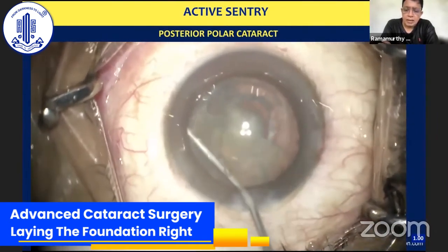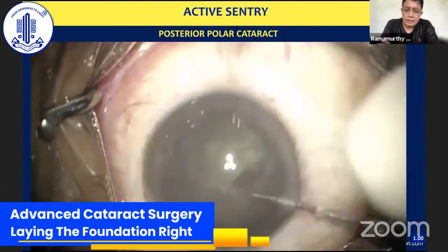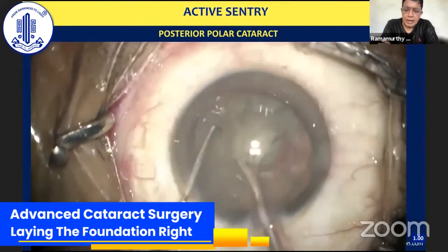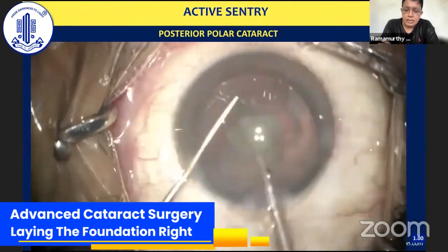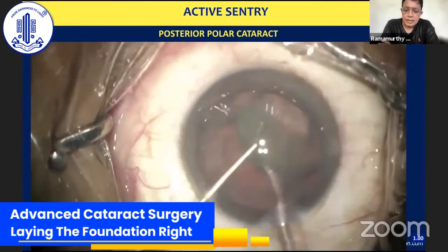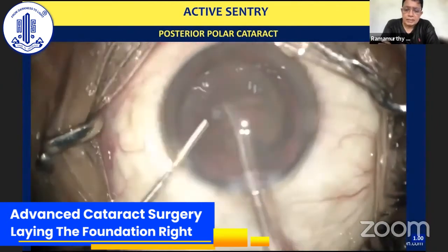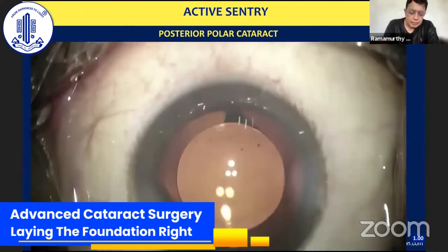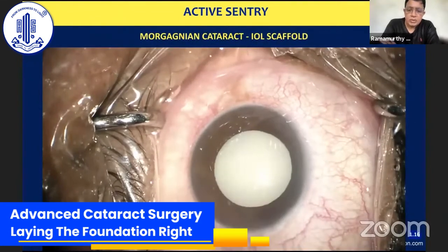Once there is debulking of the capsular bag, then this is a time when you can even go ahead, because there's no pressure on the capsular bag unless there's a pre-existing capsular rent. Then you can do a gentle viscodissection so as to reposition the nucleus fragment in the right place and go ahead with the removal of the nucleus fragment as well as the epinucleus and implant the intraocular lens of your choice. I think this is the last of my videos.